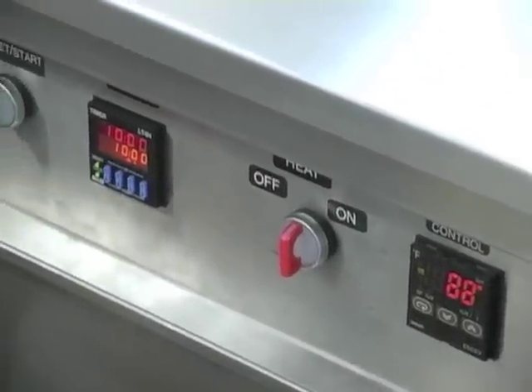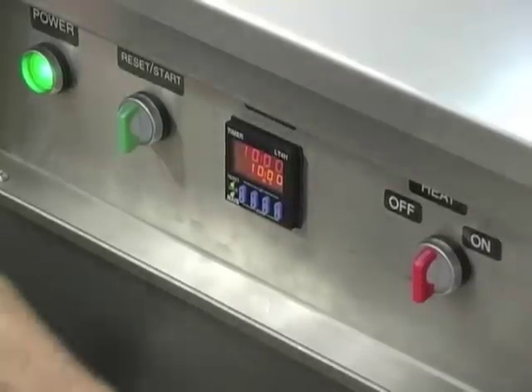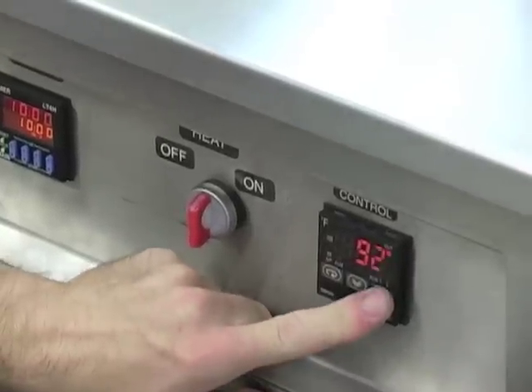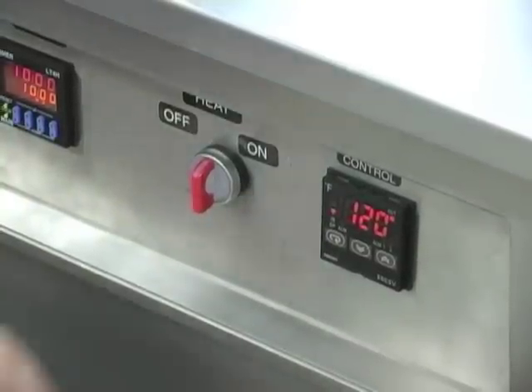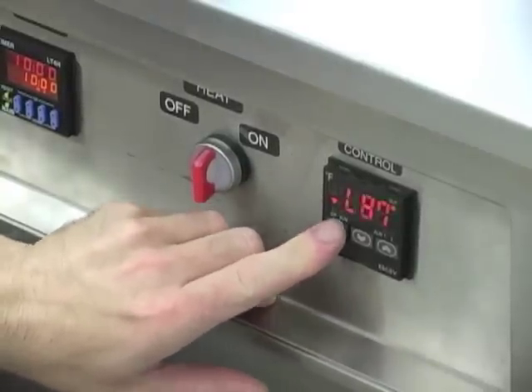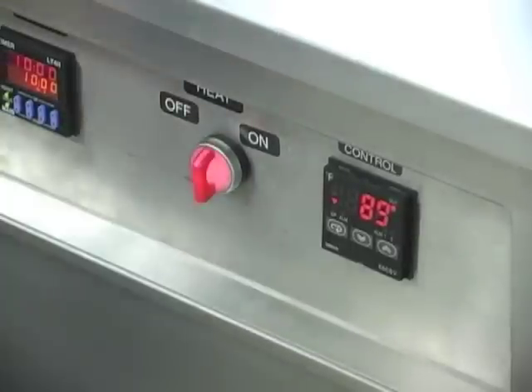The timer is set at the factory for 10 minutes, and it takes approximately 10 to 15 minutes to dry the tooling when it comes out of the rinse tank. The temperature control is set at the factory for 120 degrees, and it displays the present temperature during normal operation.